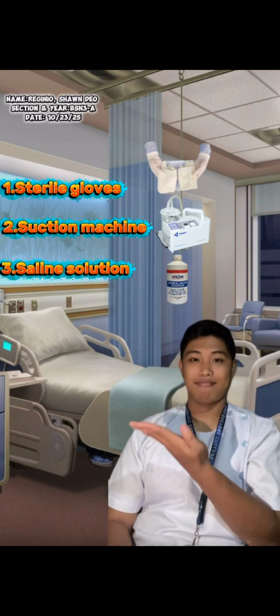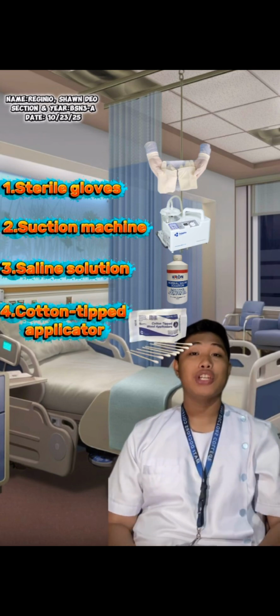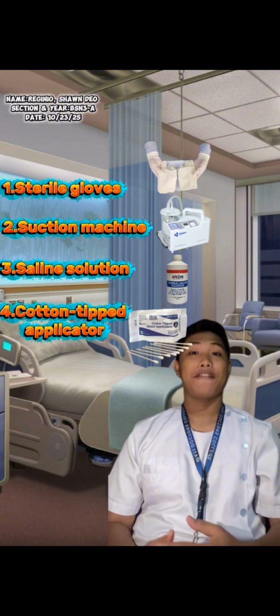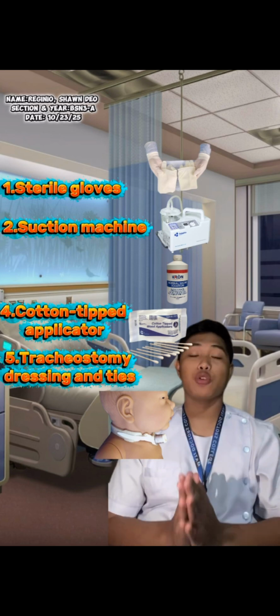Third, we have saline solution to clean the opening and soften the dried mucus. Fourth, we have a tip applicator to gently clean around the tracheostomy area. Fifth, we have tracheostomy dressing and ties to cover and protect the opening and keep the tube secure.